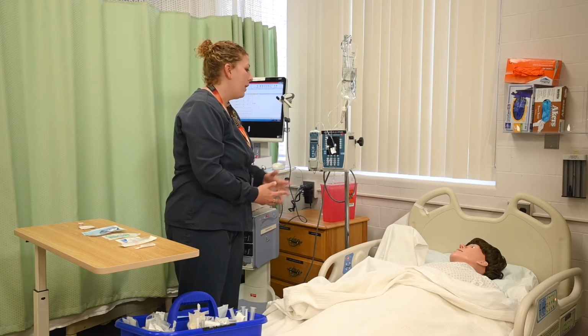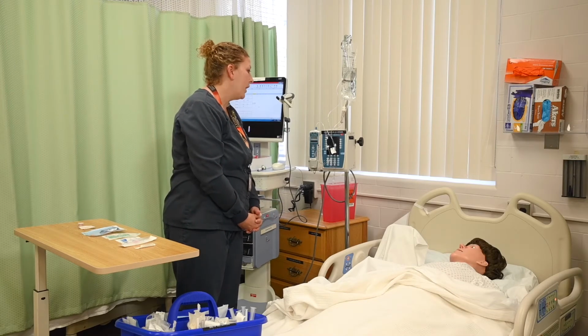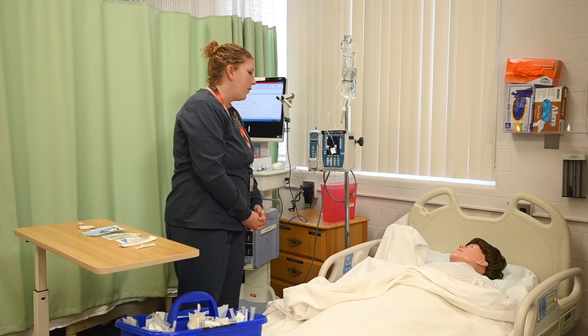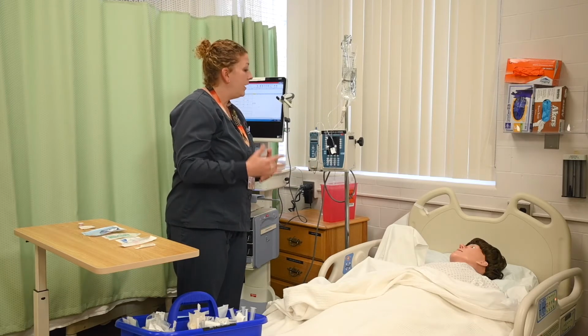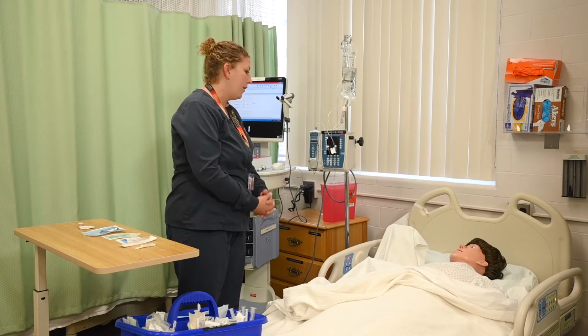We're going to hook up your IV fluids. You're going to get 0.9 sodium chloride for your dehydration, and we're going to administer that continuously. We're going to watch your site and ask that you watch the IV site also to make sure that there's no swelling or redness as the IV infuses. If you get up out of bed and move around at all, we ask that you call the nurse so that we can be careful that your tubing doesn't get snagged, you don't trip over anything, etc.